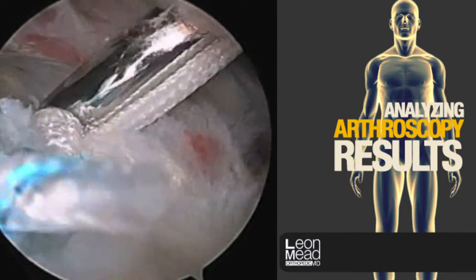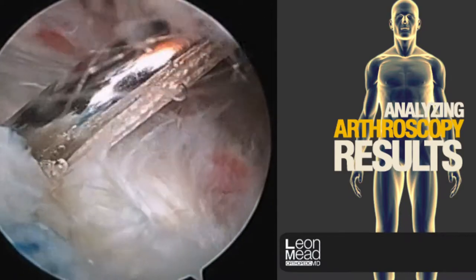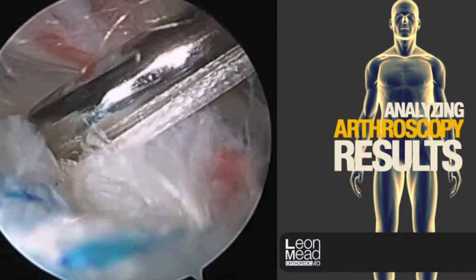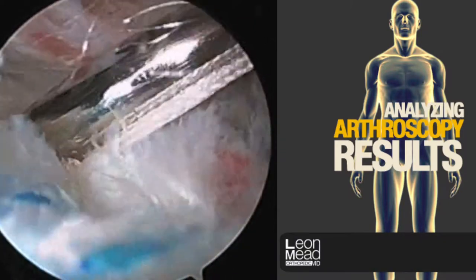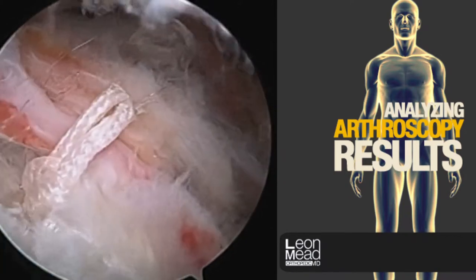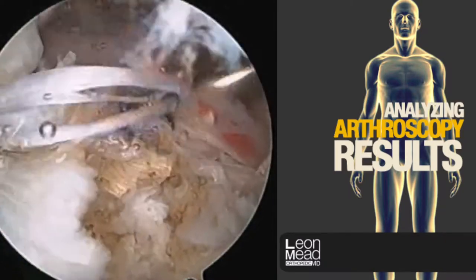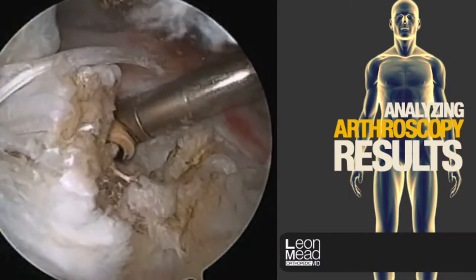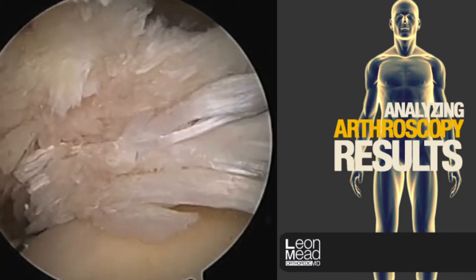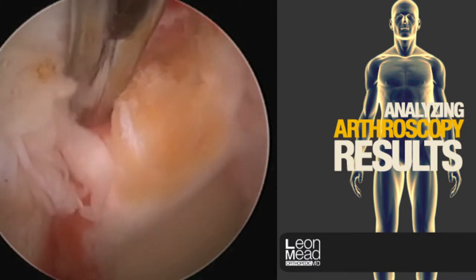Applying tension to one limb helps tighten it down and holds it in place so that when additional loops of suture are placed, the knot is less likely to slip. There we've just cut the suture we've tied. Because we've transplanted the tendon, we need to remove the part that now attaches inside of the joint itself. We can see how markedly abnormal this tissue is. Here we've removed it back to its base.